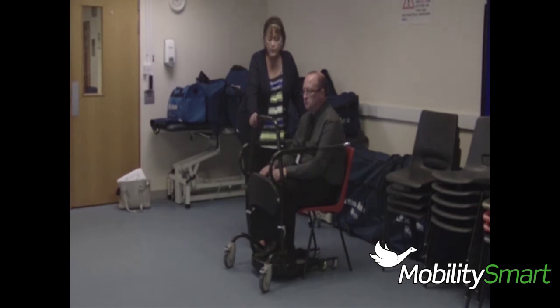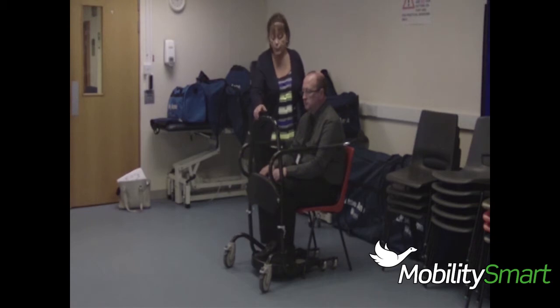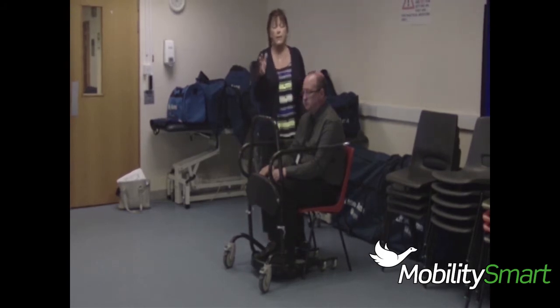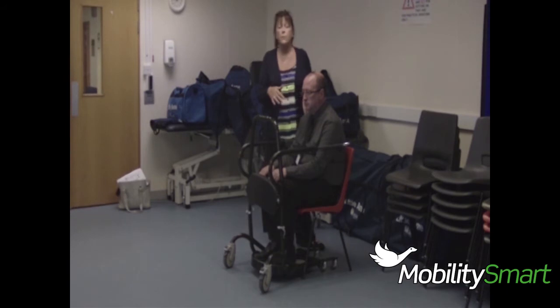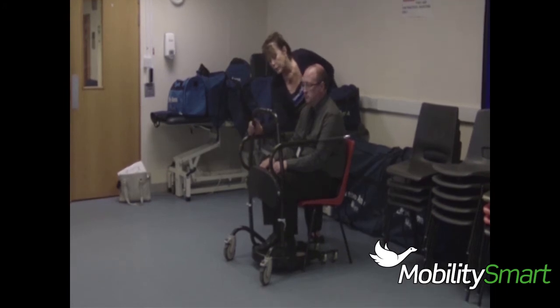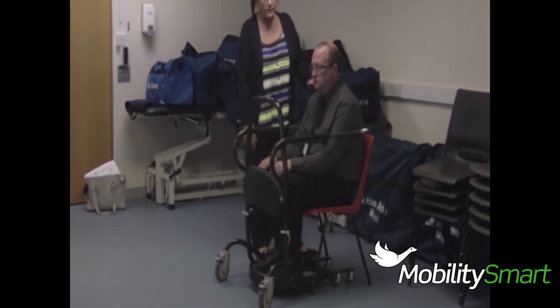They now have the options of getting themselves up, so they can either pull from this front bar, or if they can reach, they can push up from the side bars. Or indeed, when we're working with, say, the CVA clients or somebody that's lost the use of one side, amputees, that type of client, they can lay the arm along the side like so and grip here, just to give them that little bit of extra whammy in order to get themselves up.